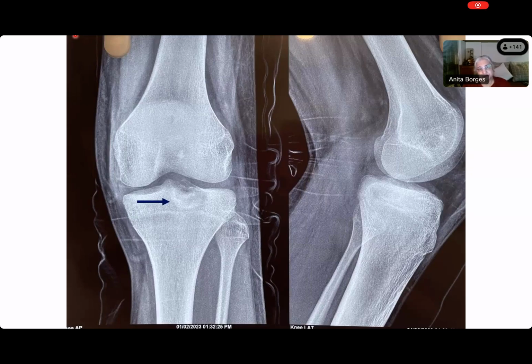The X-ray shows a sclerotic rim lesion involving the center of the epiphyses of the tibia. Excellent. Very good. Yes. It has got a sclerotic rim. It's extremely well defined, right? So there is a narrow zone of transition, but it is also lytic. It's not entirely sclerotic, is it? No, the center of the lesion is sclerotic. Yes. It has got some lytic component. It has some sclerosis because what you're looking at is a projection. You're projecting the back to the front, and you have that.